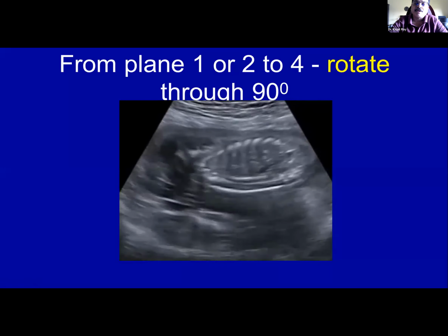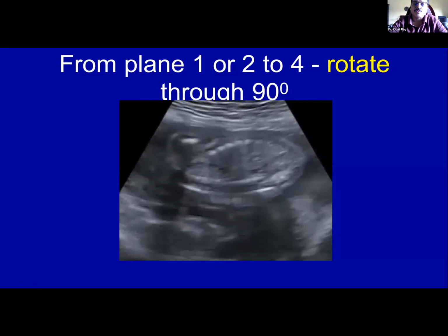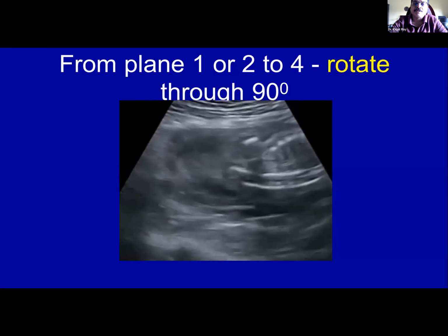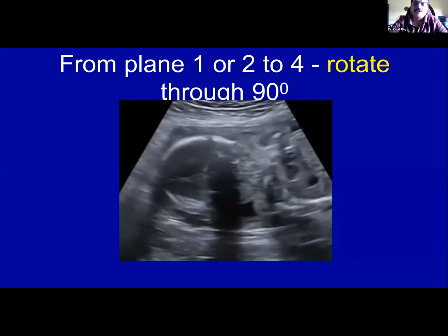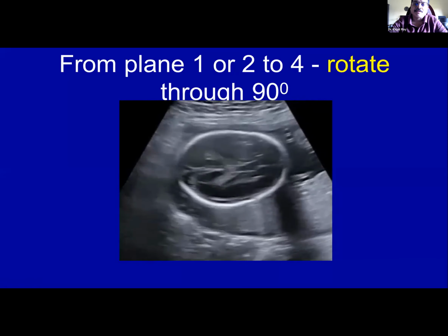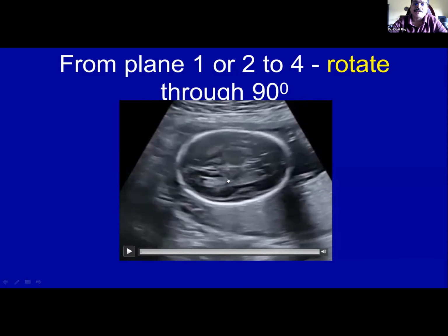either sagittal or coronal section of the spine. You go to the head, cross the neck region. Just after the neck region, you move your probe at right angle. So you will get the transventricular plane. You are getting the transventricular plane.